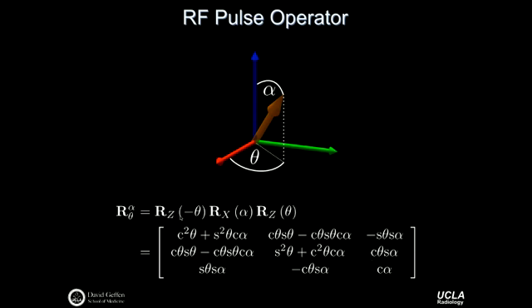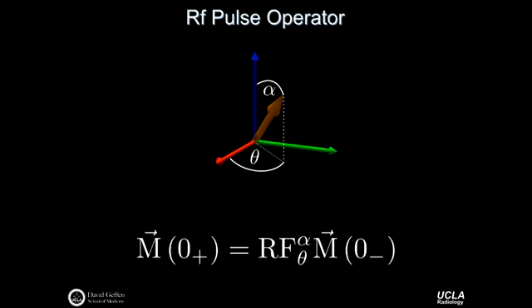What that gives you is just a relatively cumbersome matrix of sines and cosines. So I've shorthanded things here, C for cosine, S for sine, and then inserted and carefully kept track of my pluses and minuses, and you get this kind of clumsy result. No reason to memorize this. This is a really useful thing to use in something like MATLAB, and we can do exactly that.